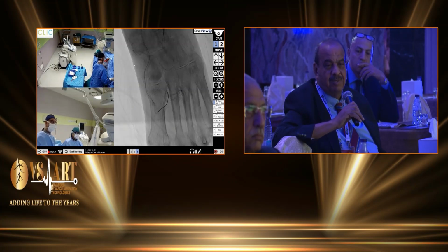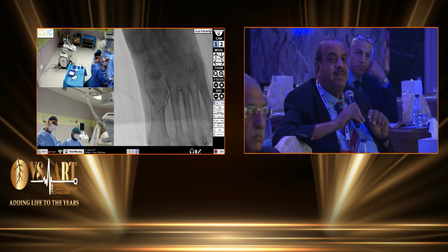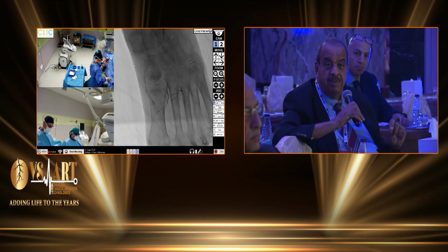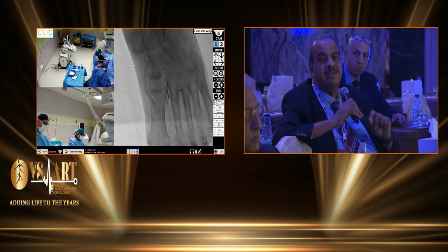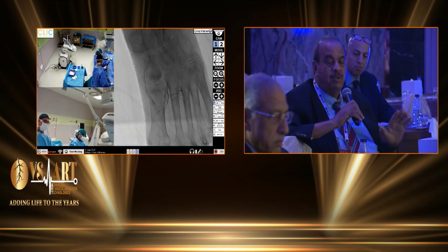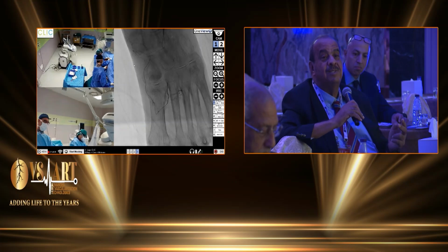My point is, we have to differentiate between BTK treatment for critical limb ischemia and BTA treatment for chronic resistant deep-foot ulcer healing. For critical limb ischemia, usually 1 or 2 vessels infrapopliteal is not a big problem to have lesion.